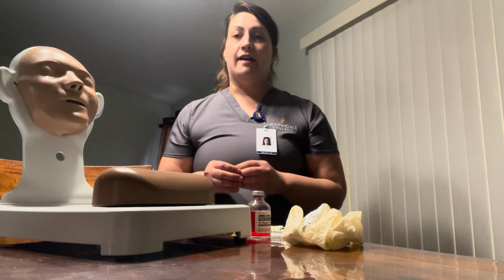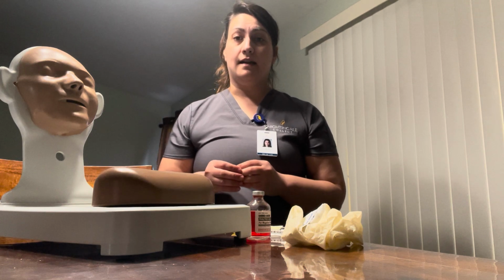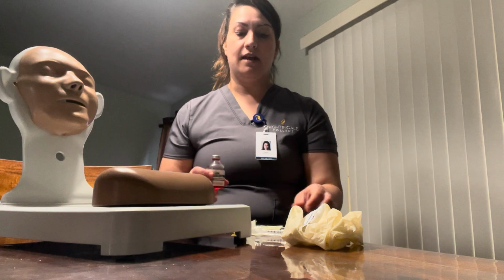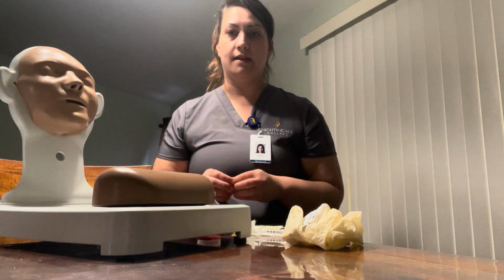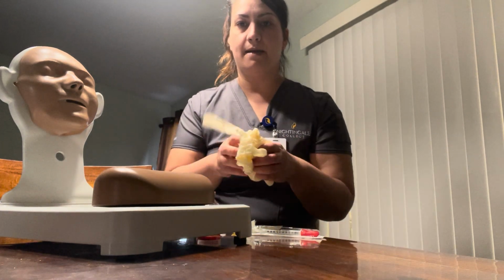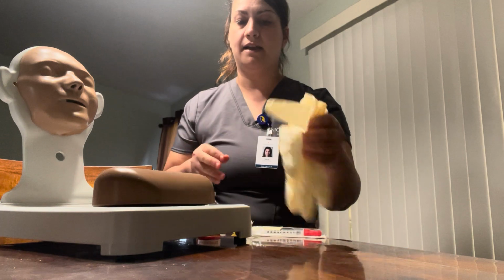So then I will verify in the MAR the patient's medication, which is heparin, and we're giving our patient 1 milliliter. All right, next I'm going to do hand hygiene and apply my clean gloves.